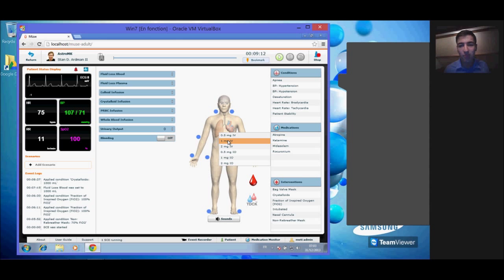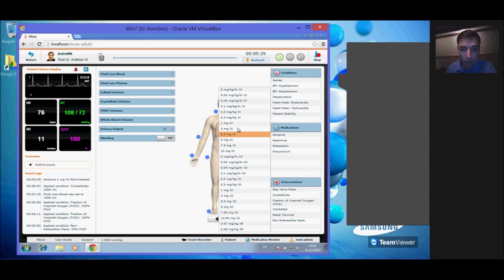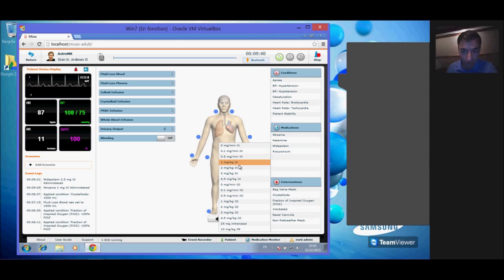With atropine, so yeah, all these are. This is the general anesthesia protocol that I recommend, and that's been published previously. So that's just what I'm following. So start with atropine, the benzodiazepine. It's still receiving oxygen, and we start with the ketamine, so 2 milligrams per kilogram.